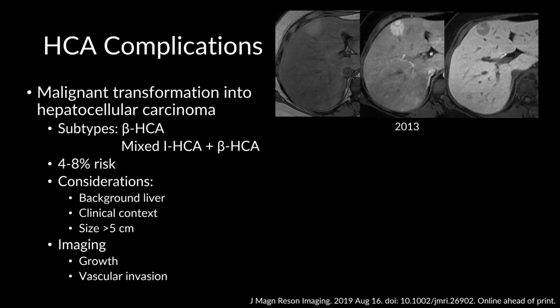If the clinical picture is a little bit atypical, such as a postmenopausal woman where we're seeing a lesion that kind of looks like an adenoma, that's kind of a red flag. So we'd have to further evaluate perhaps. The size consideration of over 5 centimeters has shown increased risk in malignant transformation. So we use imaging to assess for growth and to assess for vascular invasion.